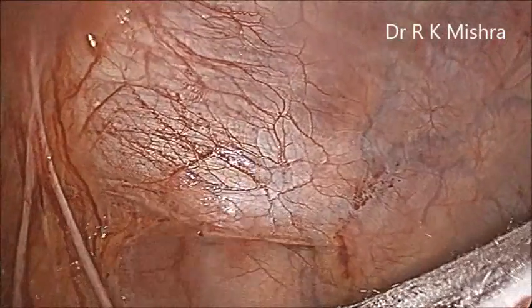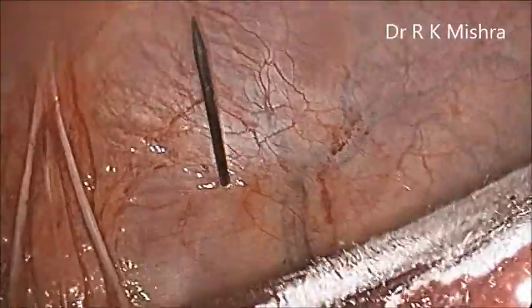Now we will fold it like a sari — like a cigarette fold, like pleated. Then we will hold it with one big long-jaw artery forcep and push it in. And here it goes — this is the mesh inside.